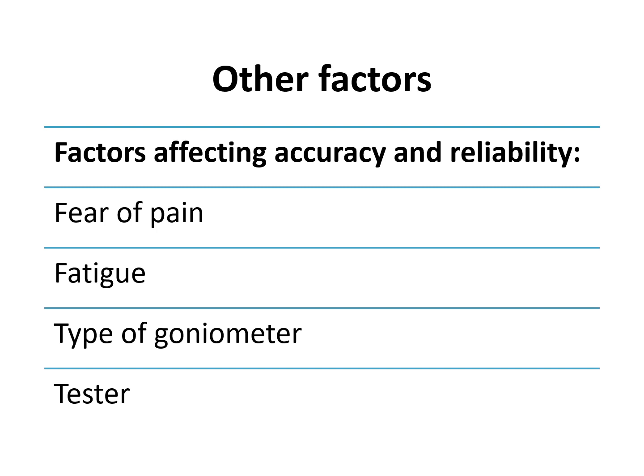Or if you have made the patient do a lot of exercises and immediately after exercises you want to take range of motion without giving a break to the patient, again it will lead to fatigue and your range of motion won't be accurate and reliable. So you make sure that you have given ample time for the patient to relax and recover before you take range of motion. The patient should not be fatigued.